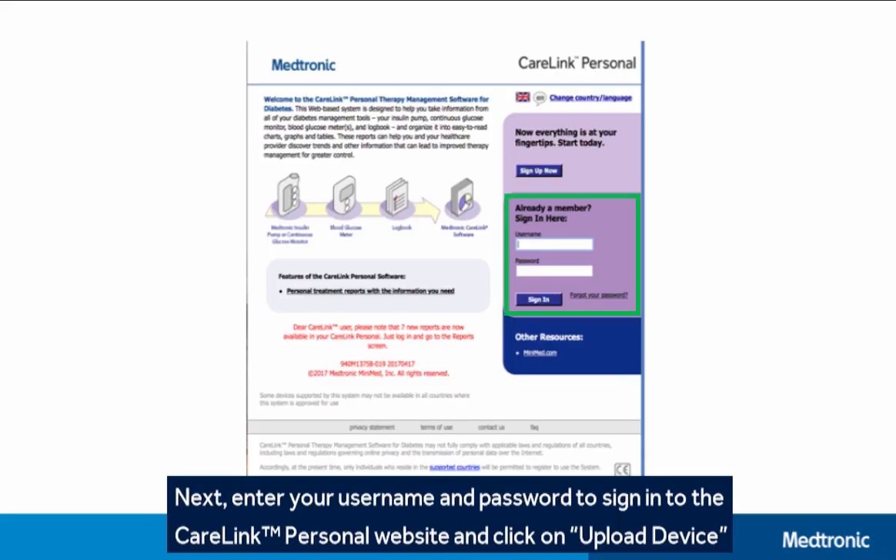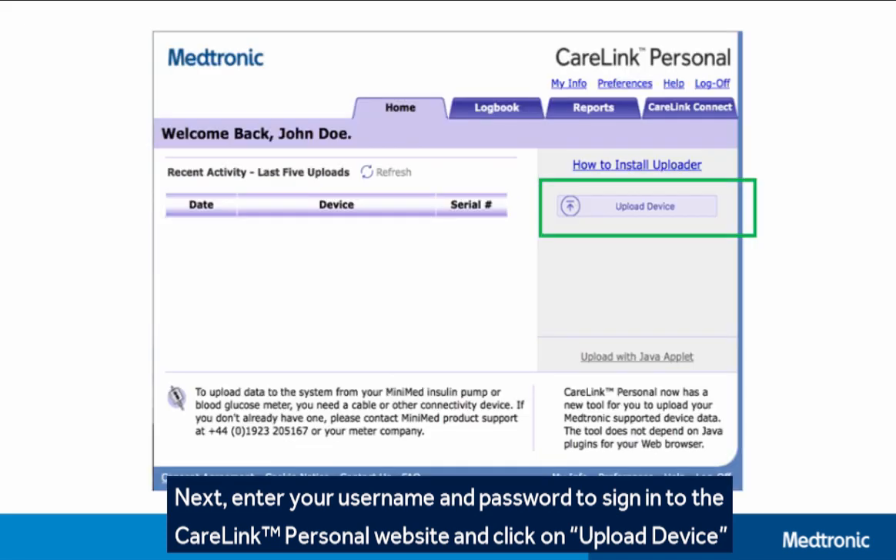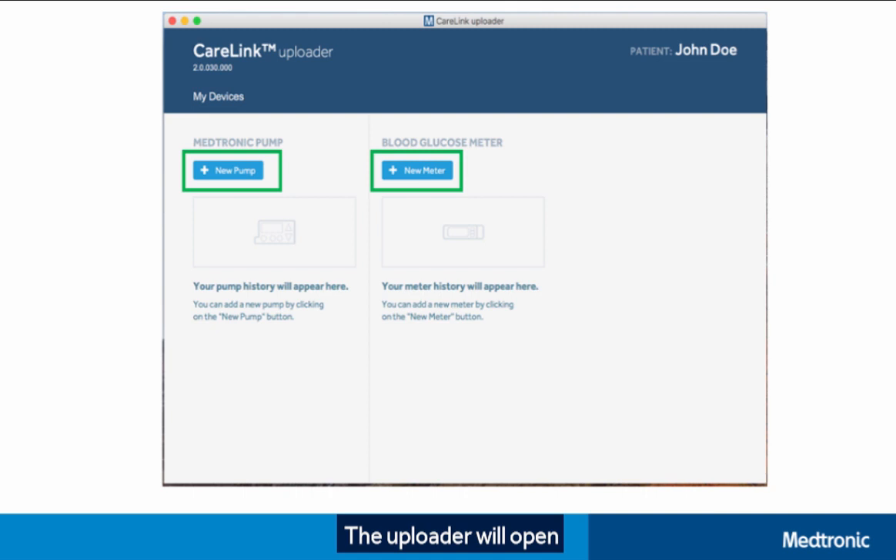Next, enter your username and password to sign in to the CareLink Personal website and click on Upload Device. The uploader will open.